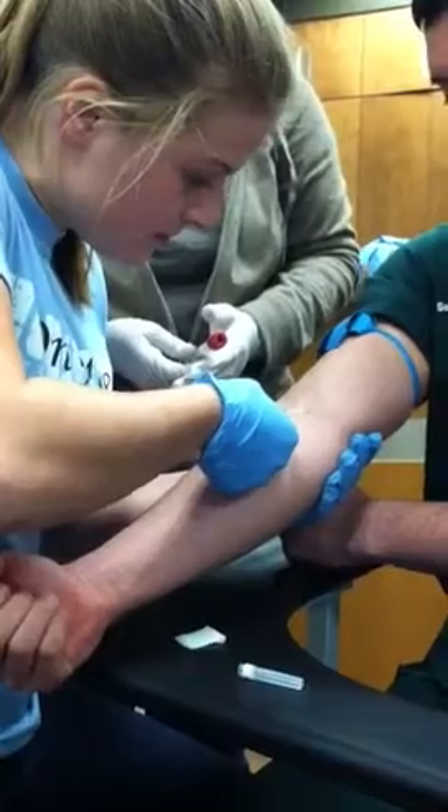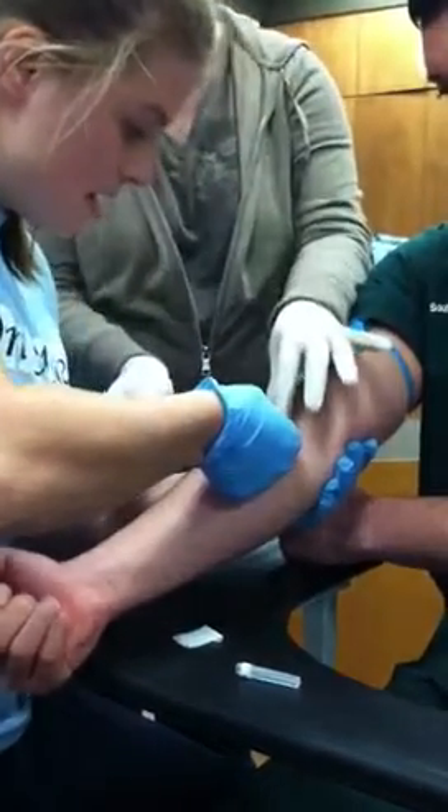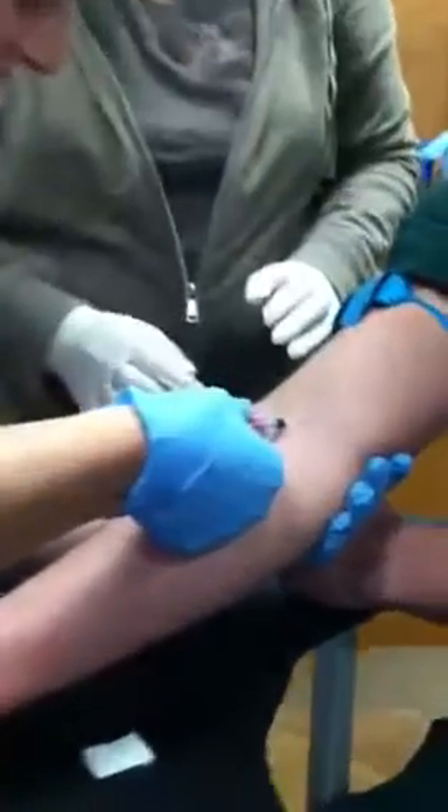See this? Stabilize it. We're going to push this on — I'll help you with that. You got it. So just hold it steady. You're fine.